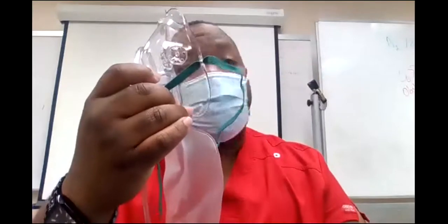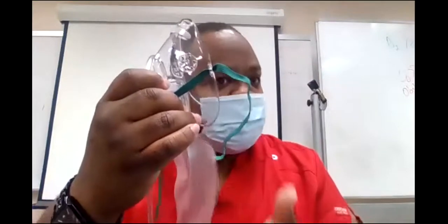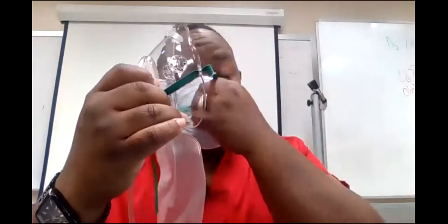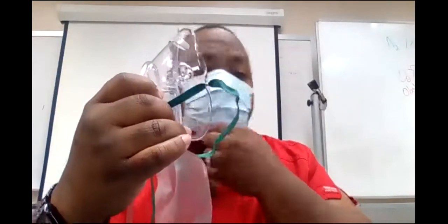That means when I'm breathing, when I exhale, a partial amount of my gas goes back into the bag. And when I inhale, that same amount that I just exhaled into the bag comes back to me. So I'm partially rebreathing my own gas, okay? So that is a partial rebreather mask, okay?